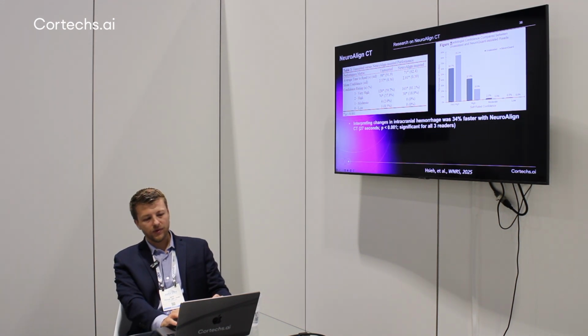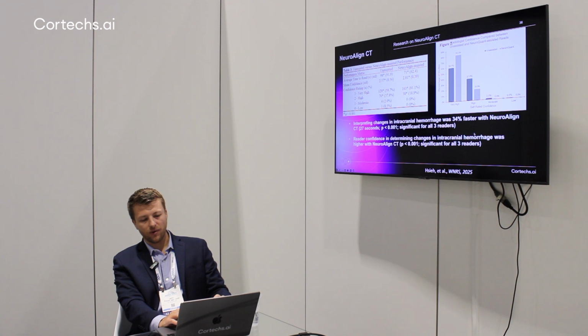But what we found, first of all, is the average time to read these studies, which we recorded, with NeuroAlign was 71 seconds, unassisted was 98 seconds, so you're saving like 20-30 seconds, and this is just in the assessment of change in intracranial hemorrhage, so it saves you time. We also rated how confident you were about whether or not there were changes over time, and in all these categories there's higher confidence, statistically significant, for all 3 readers individually. They felt more confident about it.